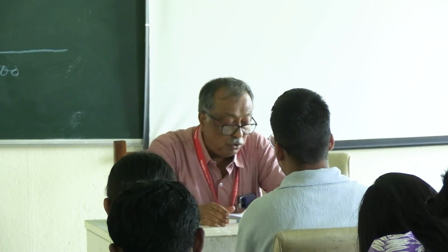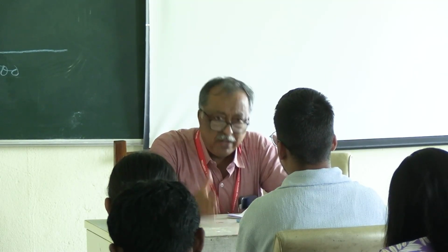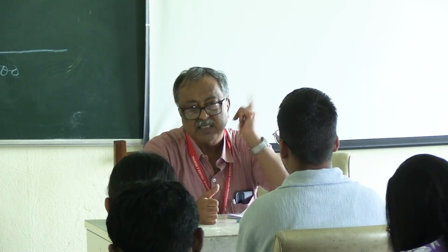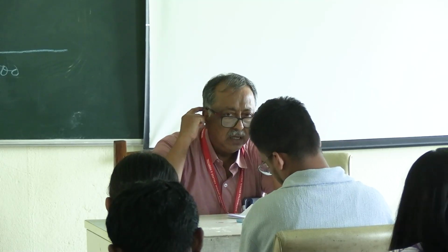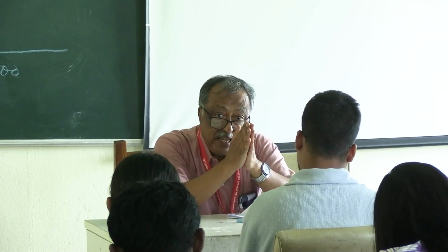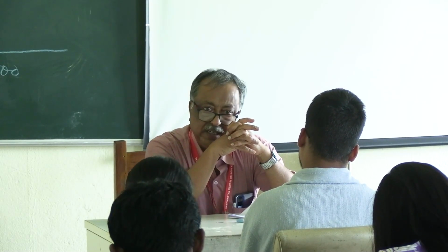I have already told you during testing the bone conduction test. Every situation, when you test the bone conduction for any ear, you should mask the opposite ear. Otherwise, there is a possibility the sound will propagate to the better ear. And in case of air conduction test, when you mask the opposite ear, a question can be there.